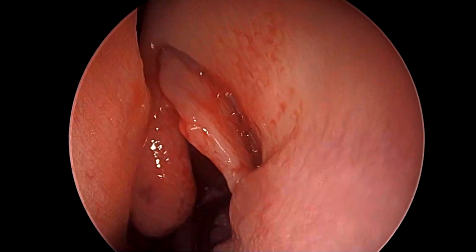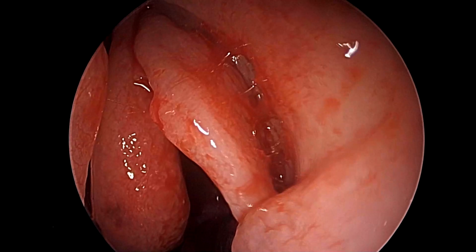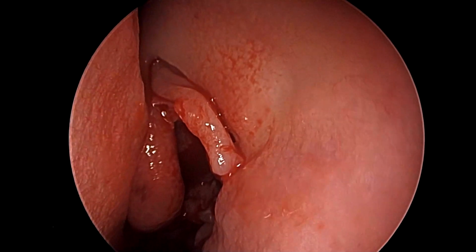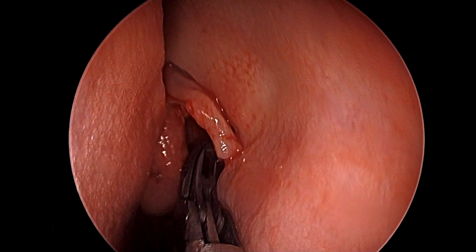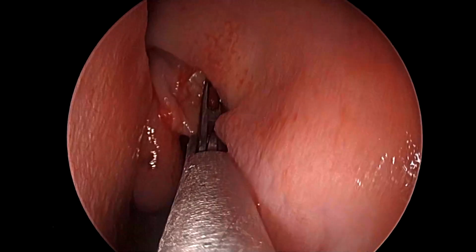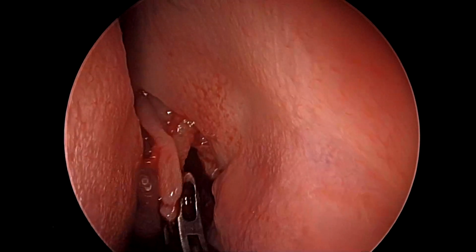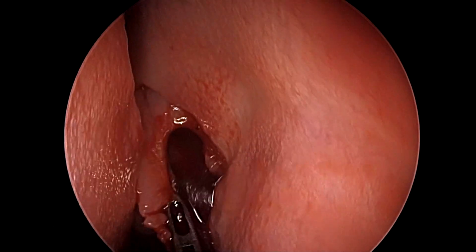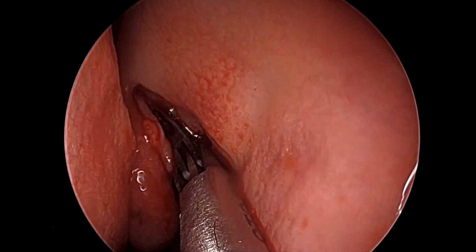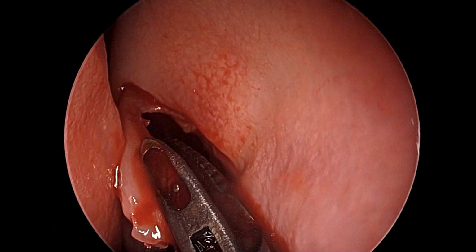Once we have back fractured the uncinate, this is just trying to open the maxillary antrum slightly with a frontal sinus curette. And then, as a standard procedure, just like we do in endoscopic sinus surgery, we use a fine 45-degree angled through-cutting forceps to resect the uncinate process flush with the lateral nasal wall right till the superior aspect of it.